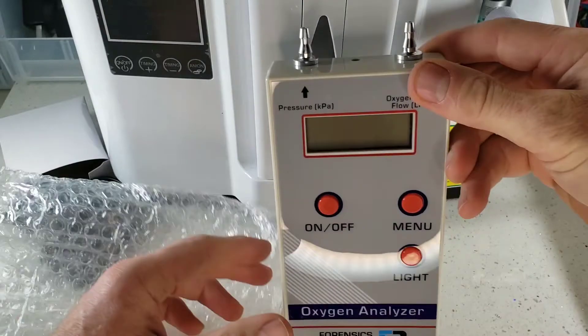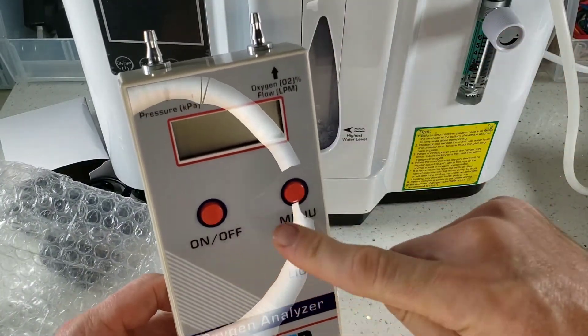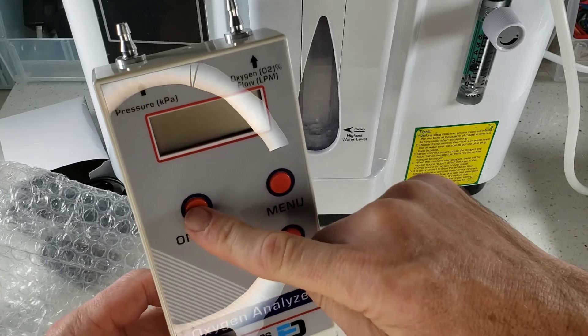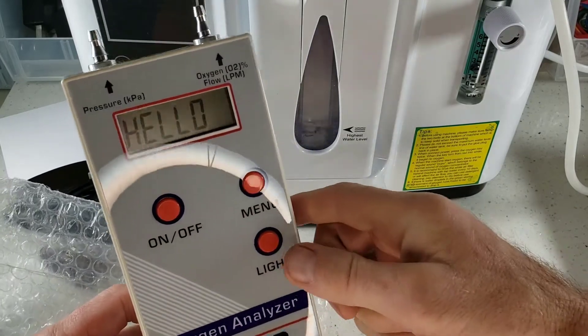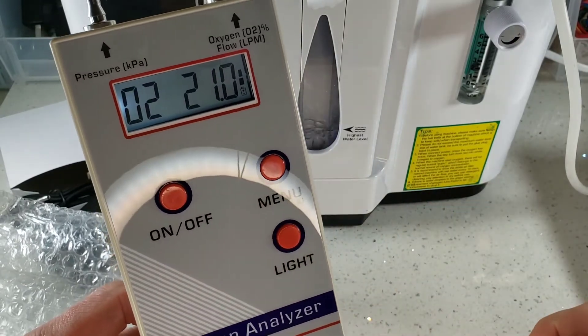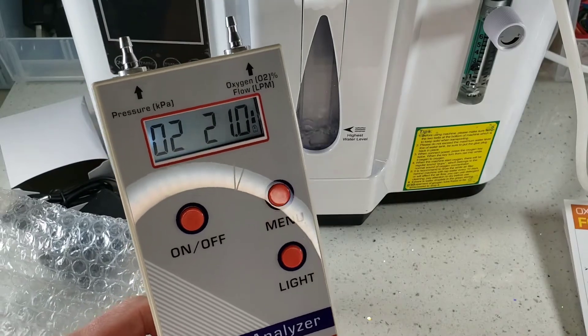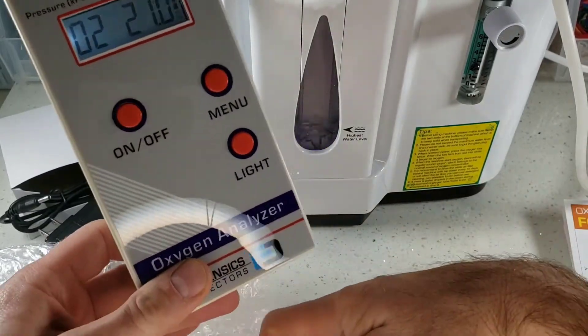Look at this little beauty. It's made for folks — I love big buttons and big text and fonts. Just go ahead and press the on button, very easy. There's a backlight — just press that — nice large digits. Before we test this, let's go through the device and see all the features.